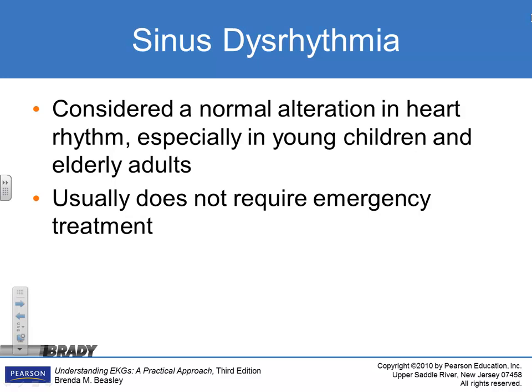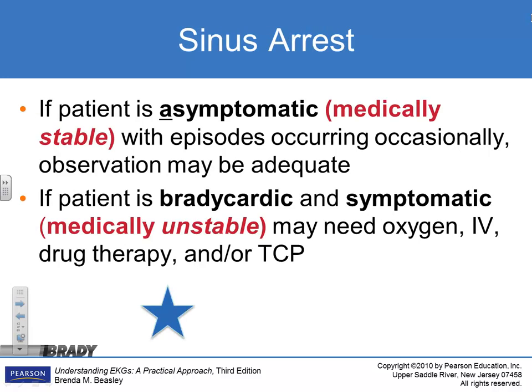Sinus dysrhythmia, we talked about this. This is not a bad thing. 99% of the time, it's no big deal. You just note it, identify it, record it, and move on. Okay, sinus arrest, we talked about that. Oftentimes, if it's just very intermittent, the patient may not be symptomatic at all. But if it's like where you can see where it's missed several complexes, then yeah, they're going to be symptomatic. You're looking for what? Signs of what?